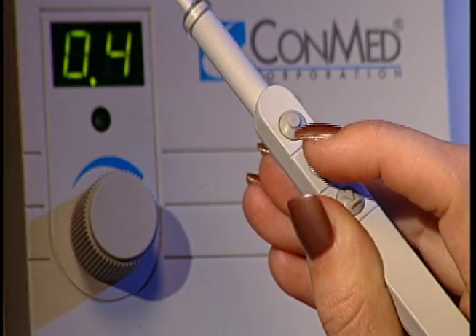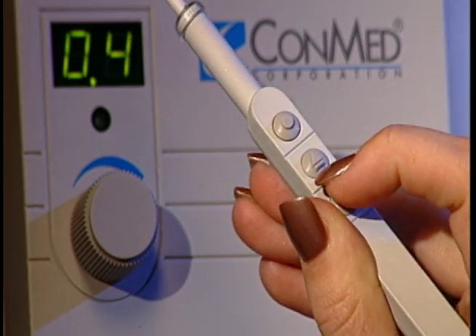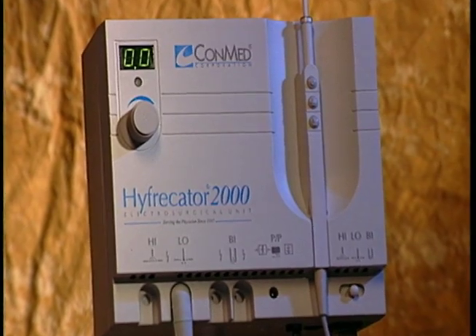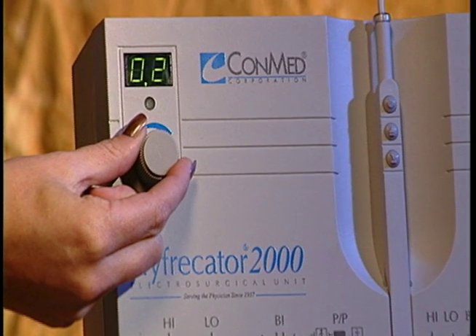It has several exclusive features you won't find anywhere else. Physicians benefit from the ability to quickly change power settings with the easy-to-use remote control pencil, and can perform procedures which require finite power settings — such as telangiectasia removal — through sensitive, reproducible low-power controls.